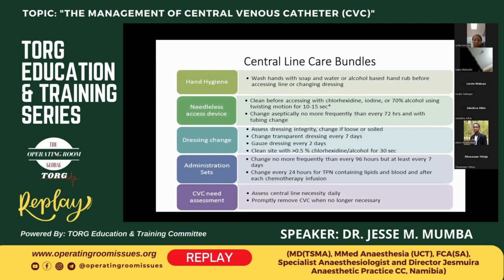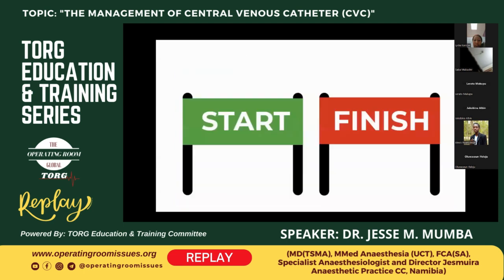If you're not the one to make the decision, you should still ask those that need to make the decision, should we keep this central line? And once you say it's not needed on a daily assessment, it should be promptly removed. And also be on the lookout for change in infective markers and also the changes in signs and symptoms that the patient may have, pointing to the fact that they have developed a central line associated infection. With that, I'm going to end where we started.